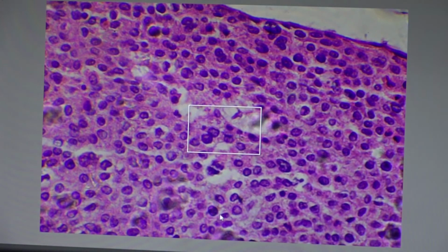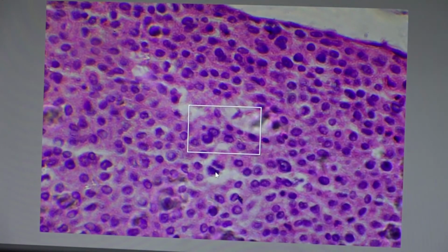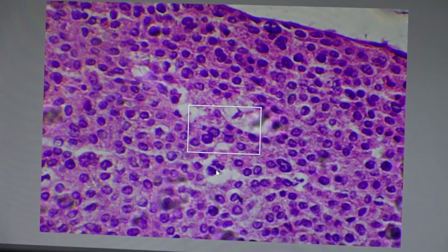These cells are malignant cells, hyperchromatic, slightly pleomorphic. This is the mitotic activity, mitosis, abnormal mitosis. The features of malignant cells are hyperchromatism, pleomorphism, large nucleus cytoplasm ratio, prominent nucleolus, abnormal mitosis, atypia. All these features are present here.